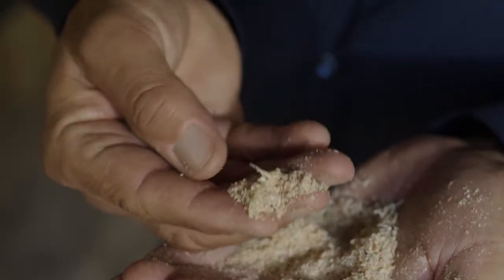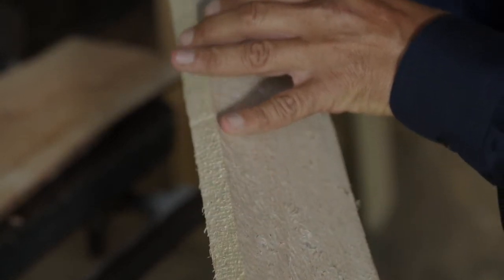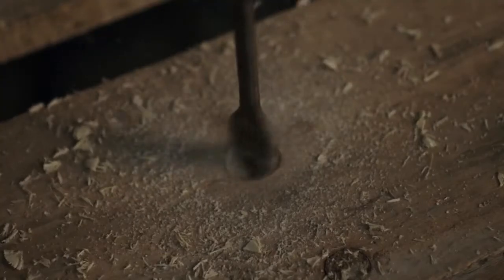The saw is very efficient, but the friction generates a lot of heat, and the width of the teeth a lot of debris, and this happens with all kinds of cutting with mechanical methods. However, a saw can only make one type of cut, a straight line, and a drill can only make perfect round holes.